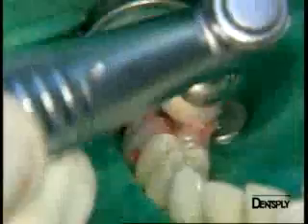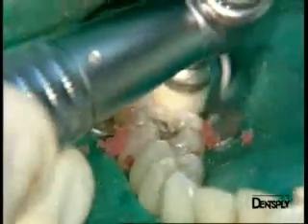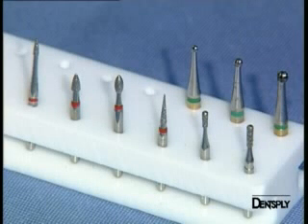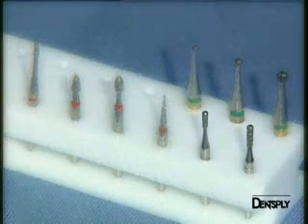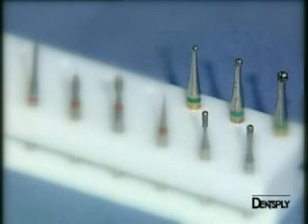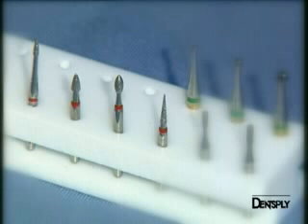Firstly, we clean all dental surfaces using the Nupro prophylaxis paste to eliminate any residue or deposit on the teeth, and we carefully wash it out afterwards. The rotary instruments can be divided into three groups: two 830-type pear-shaped burrs used to shape the cavities; ball burrs mounted on blue-ring contra-angle handpieces for excavating caries lesions; and four red-ring finishing instruments designed for finishing composites.